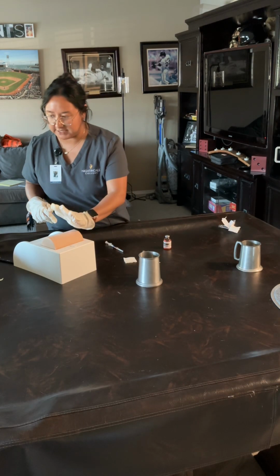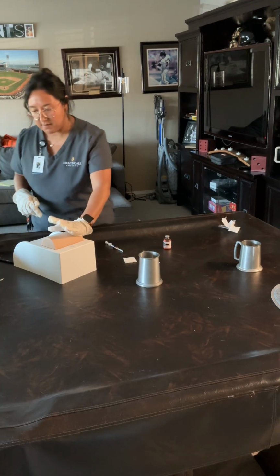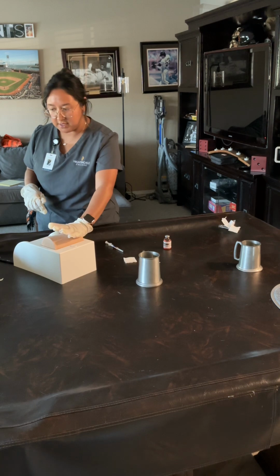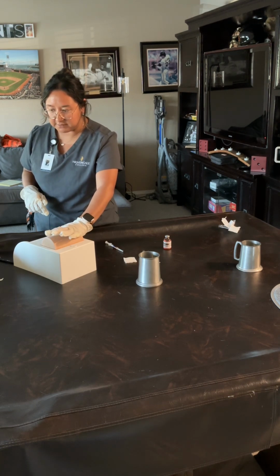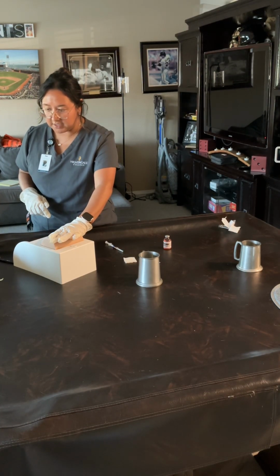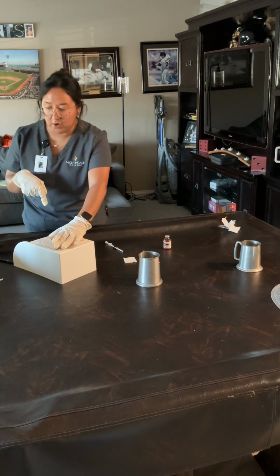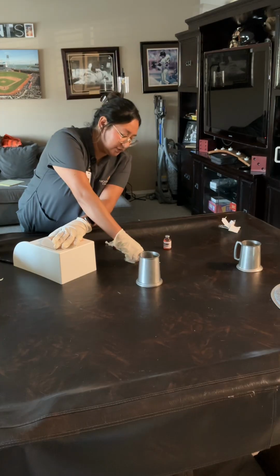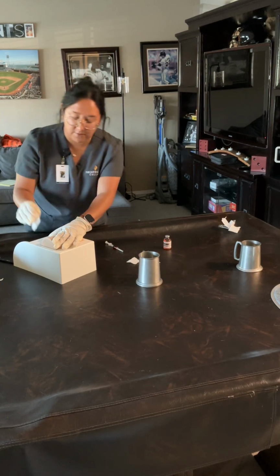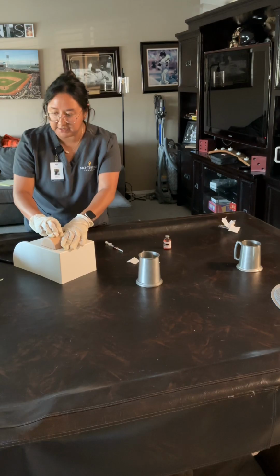I'll go ahead and put my palm face down here on the greater trochanter. My thumb will be on the groin, and my pointer finger is on the anterior iliac spine, and my middle finger will go onto the iliac crest. And then this V right here will be where I administer. I'll just use an alcohol pad for now, just to mark it, and put that there.